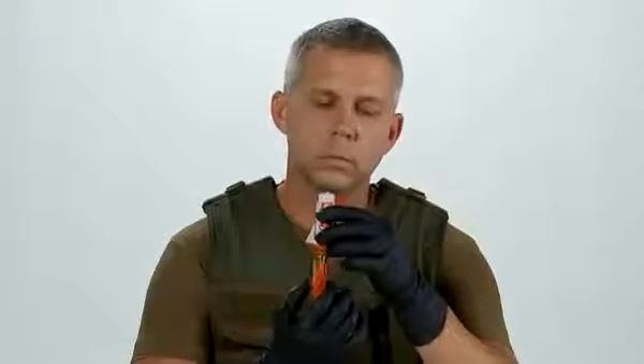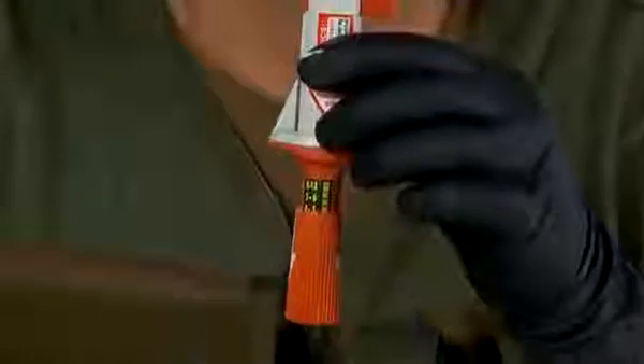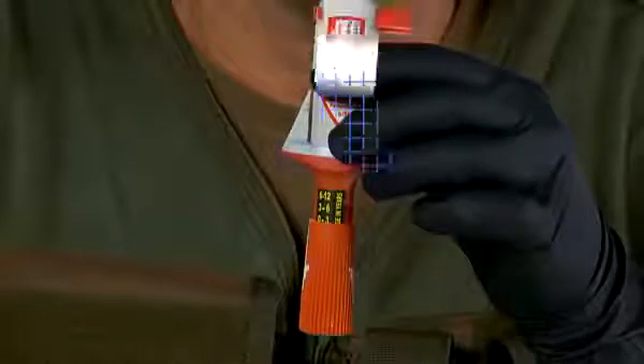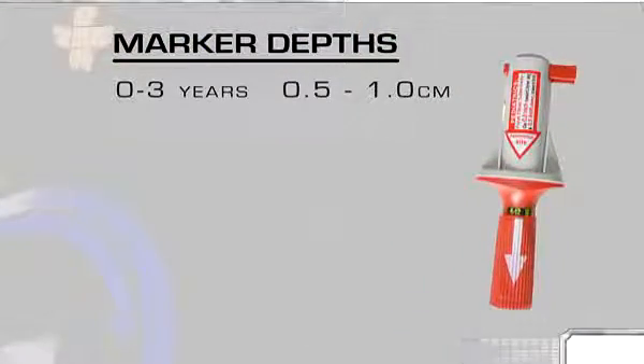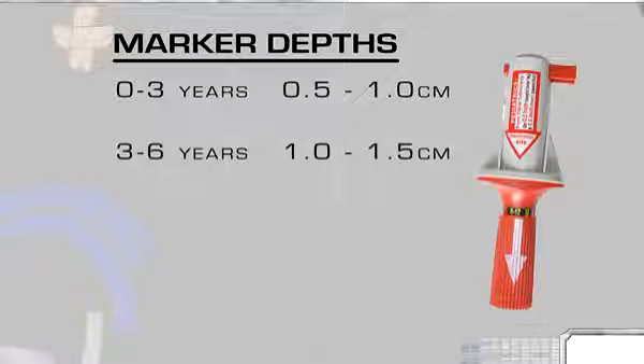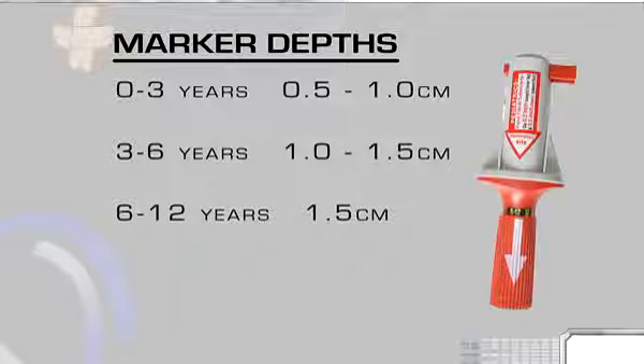Using the red barrel, adjust the BIG's penetration depth according to the patient's age. The age and depth are both marked on the device. The markers are: 0 to 3 years, 0.5 to 1 centimeter; 3 to 6 years, 1 to 1.5 centimeters; 6 to 12 years, 1.5 centimeters.